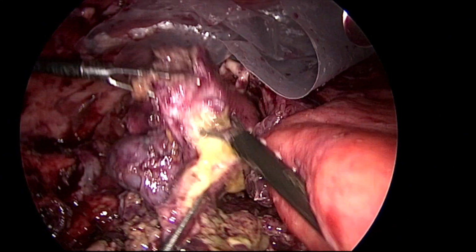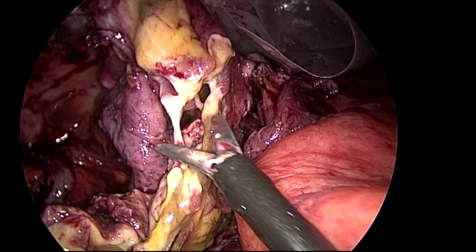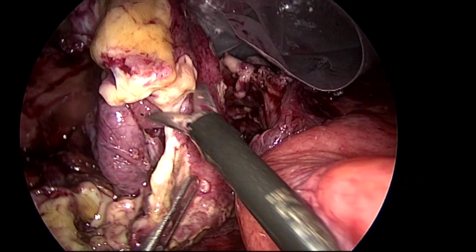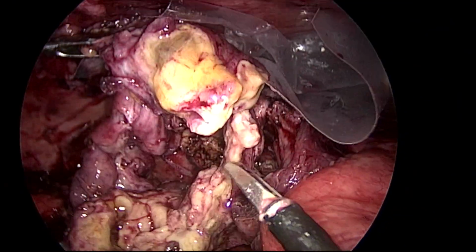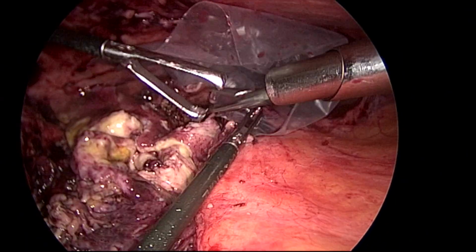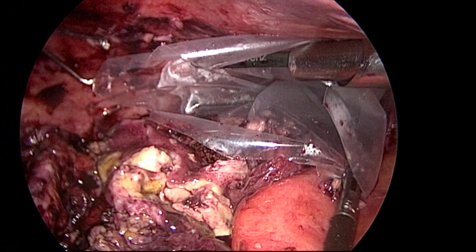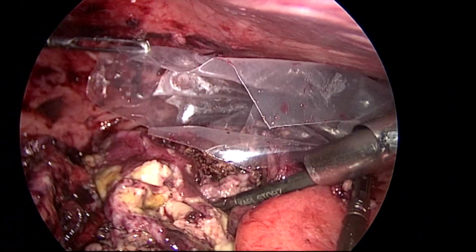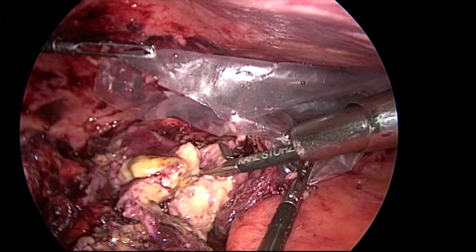Now you can see this, the entire sloughed out, gangrenous and empyema of the gallbladder. I asked the sister to hold the bag on the other side. I'm holding it on this side. So I'm placing it into the endo bag.